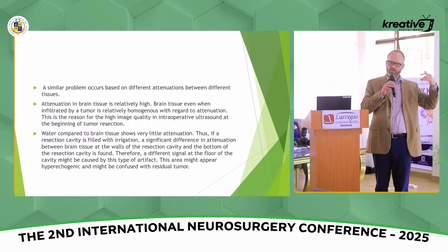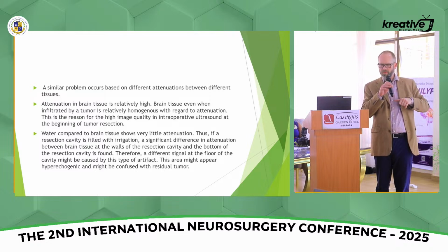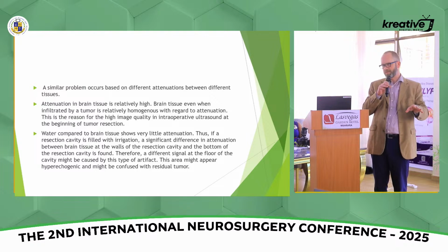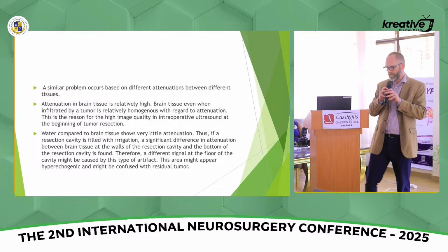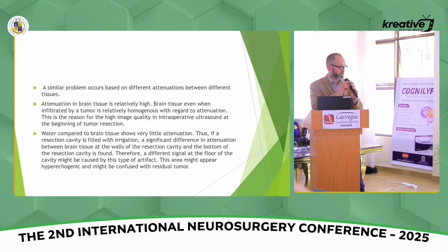You can actually put the ultrasound on the brain instead of right over the fluid-filled cavity and look over at that same tissue. If you're only going through brain to it, see how the base of the tissue compares to before, and does it look the same as surrounding white matter? That can help you distinguish that artifact.